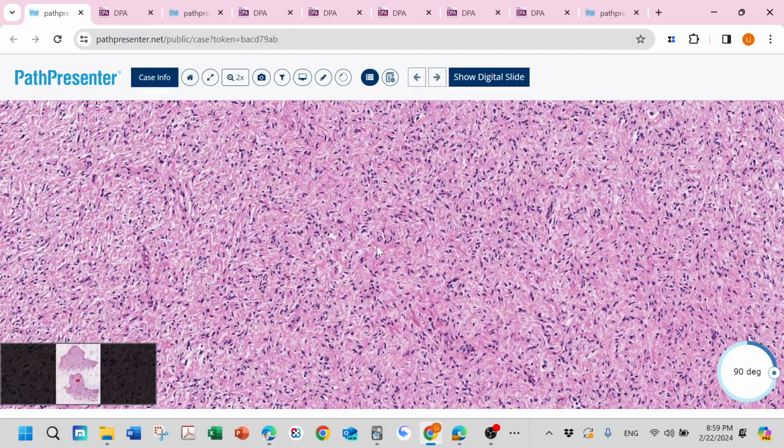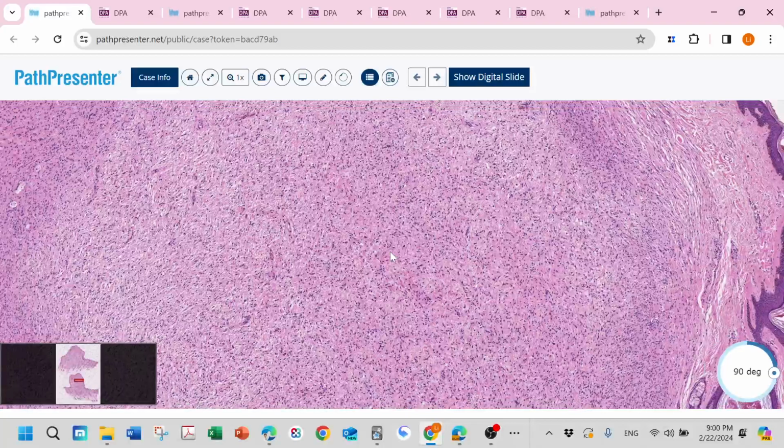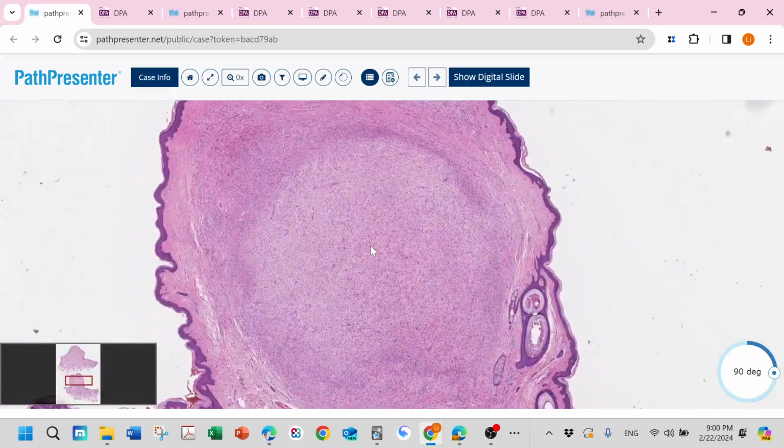And then another component is fibroblasts. So you can also use CD34 to highlight these fibroblasts. So if you really want to do the staining to prove you are right, you need to do S100, that is patchy, CD34 patchy. EMA also stains some of the spindle cell component of neurofibroma.